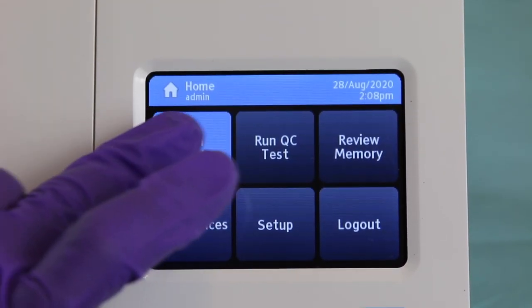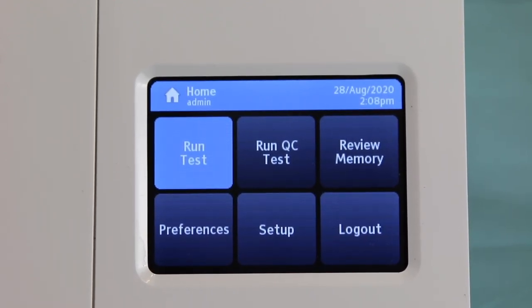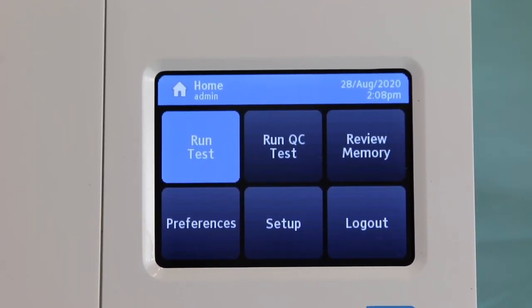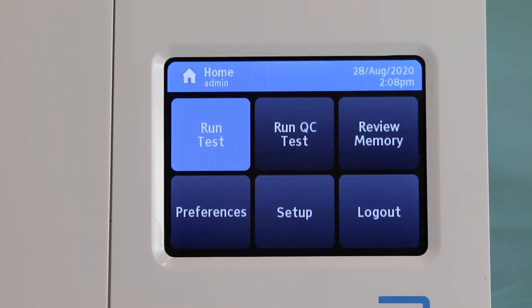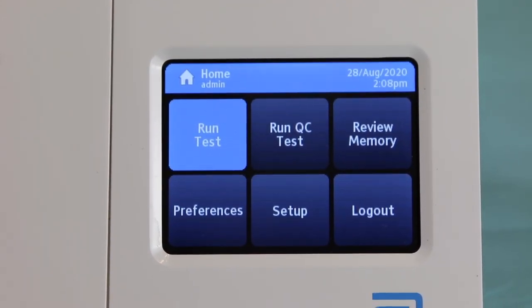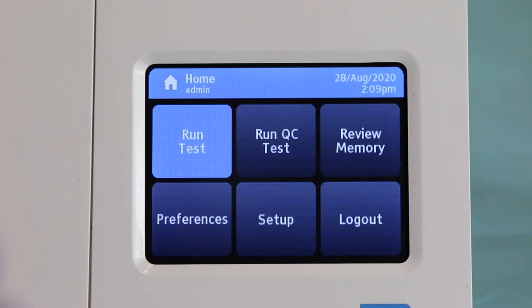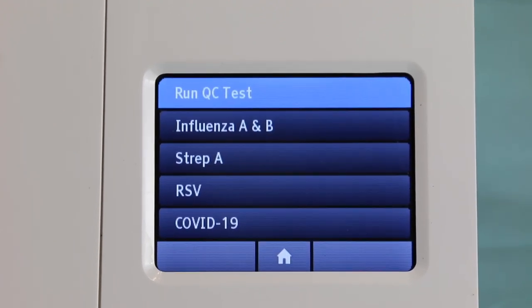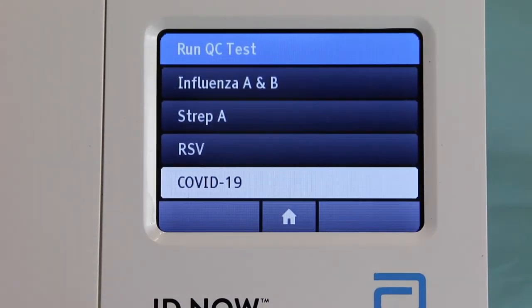Now you have to run a QC test. The QC test is the very first thing you're going to do, because the machine will not allow you to run any tests without the QC test being completed first. We are running a QC test for COVID-19, so select COVID-19.